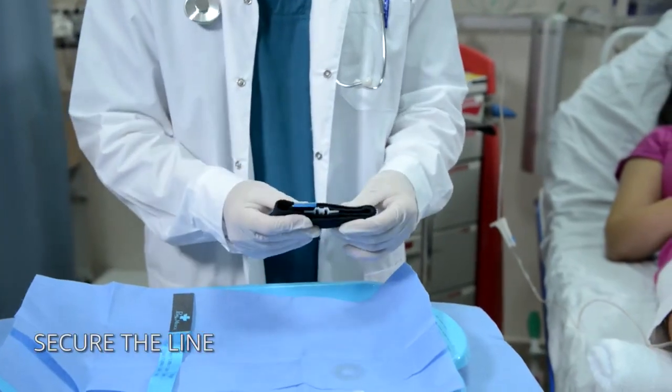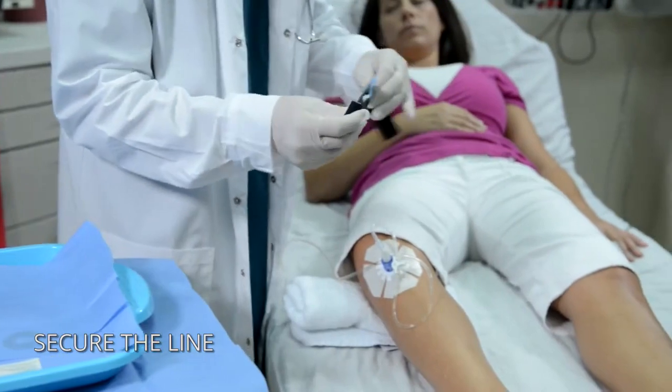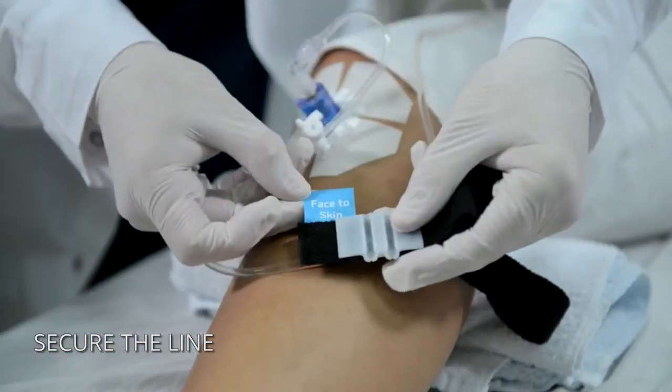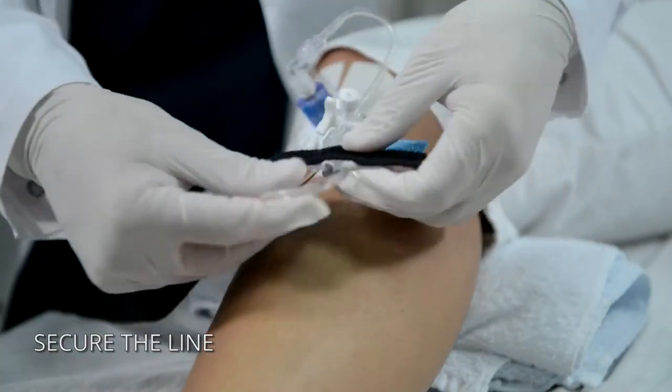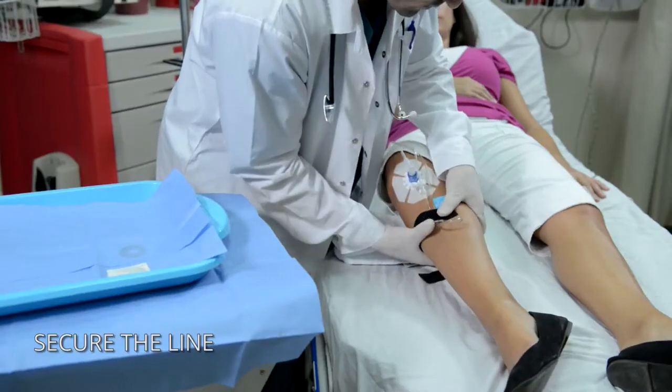Use the secure I.V. strap to provide protection against accidental line pulls. Snap the line into the quick-click connector channels and wrap the strap around the patient's leg near the access site.